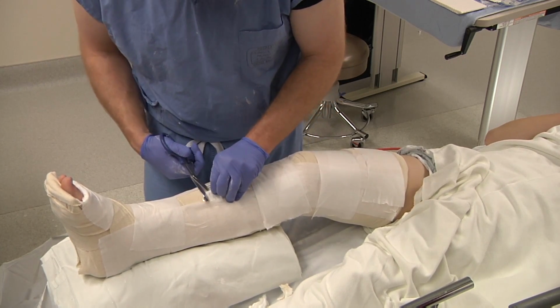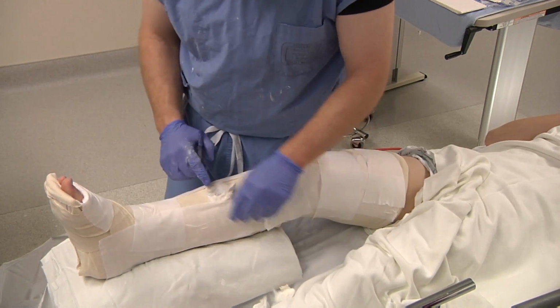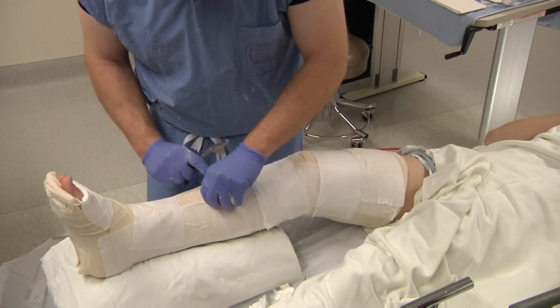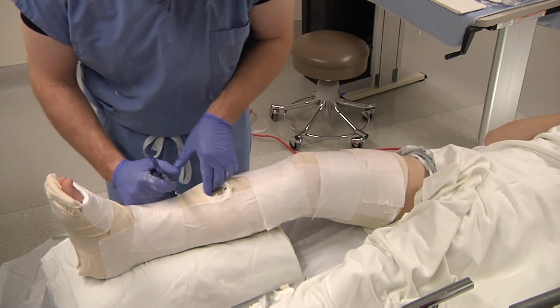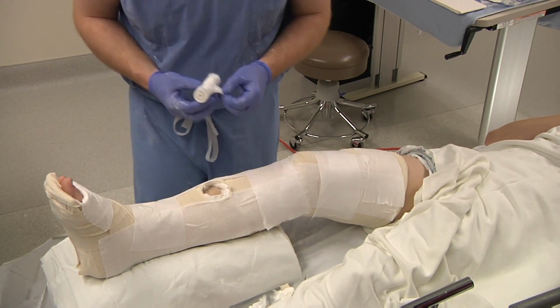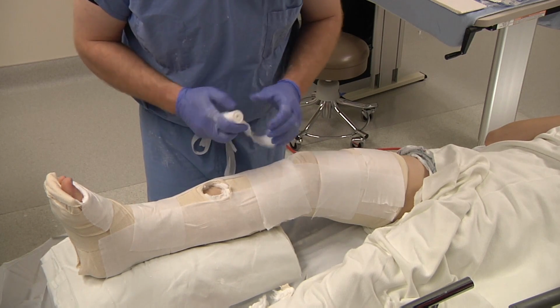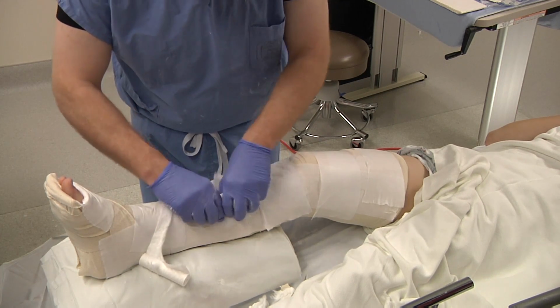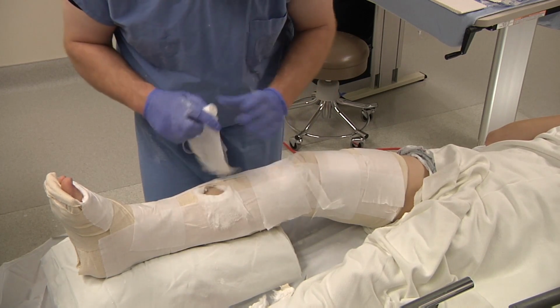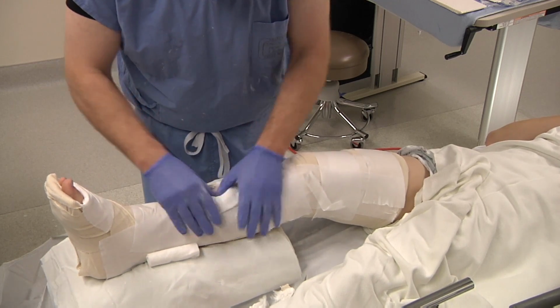remove any plaster, padding. Make sure if you do cut any of the plaster, make sure to turn up some extra padding or get extra padding to pad that as to not have any of the plaster ever contact the patient's skin. Generally, several layers are advisable. Fold it, tuck that in there.